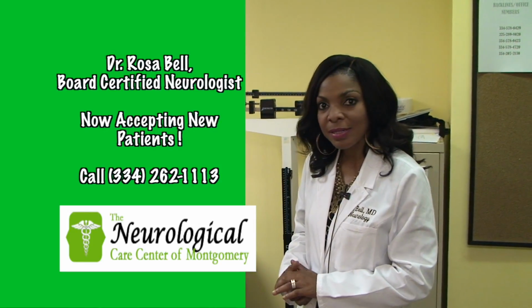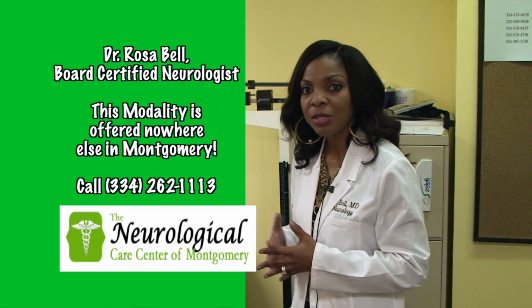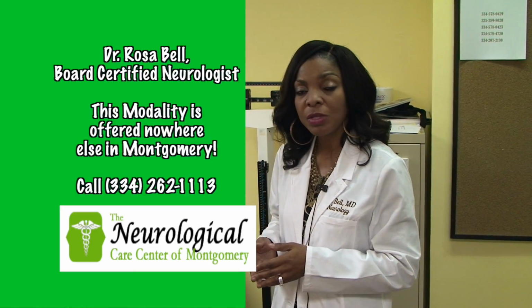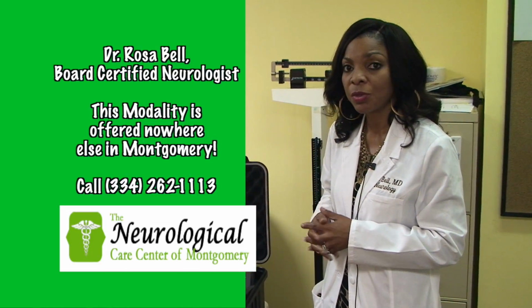I'm so excited today to share with you about our ambulatory prolonged video EEG. This is a modality that we have to help diagnose and treat patients with epilepsy and seizure disorders and other disorders, because very often with the monitoring we determine that it's not actually seizures or epilepsy and it might be something else such as a cardiac disorder.